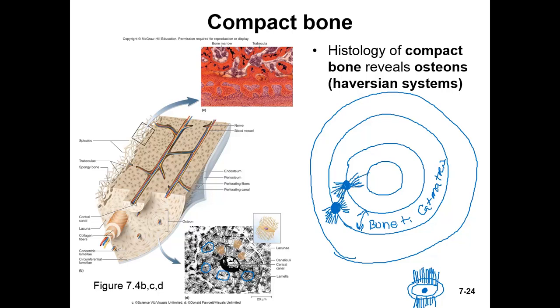And the next osteocyte would be here with the really long eyelashes going this way. And then they would actually be connecting. And then there's one out here with the really long eyelashes this way. So the dark area is the hole or the lacuna that is filled with the osteocyte. So this is the cell, and you'd have to go back and look at the picture of the osteocyte. There he is, that looks like that.